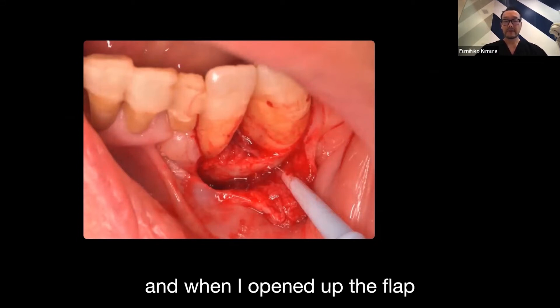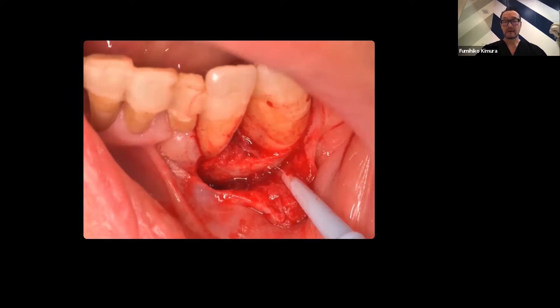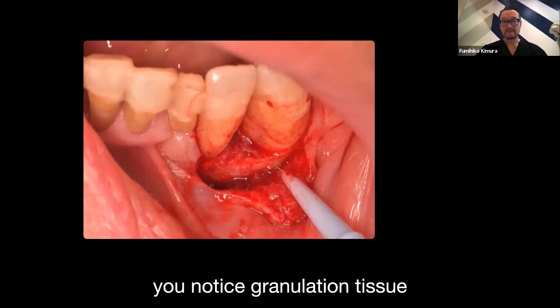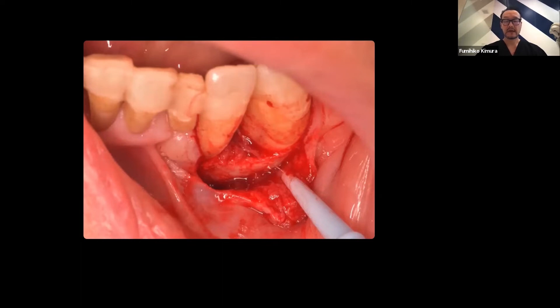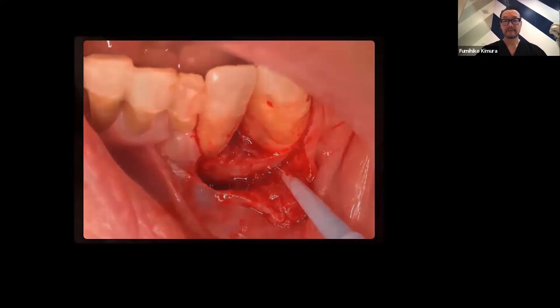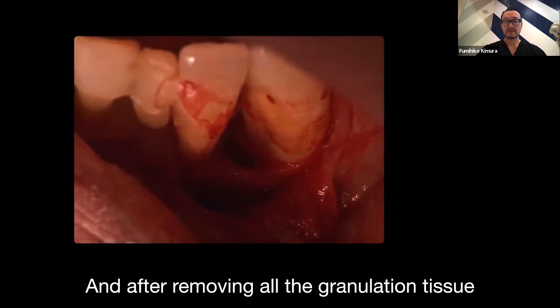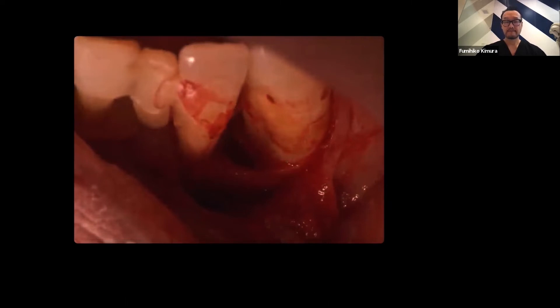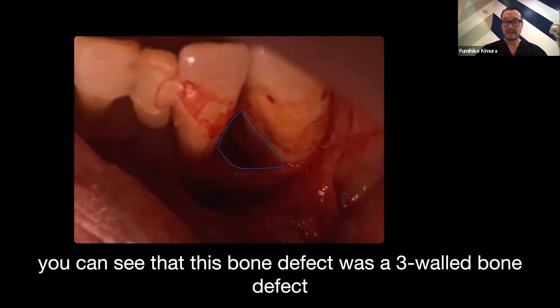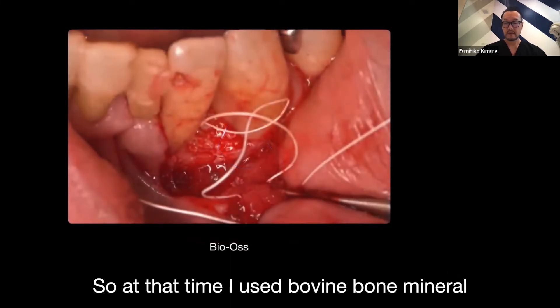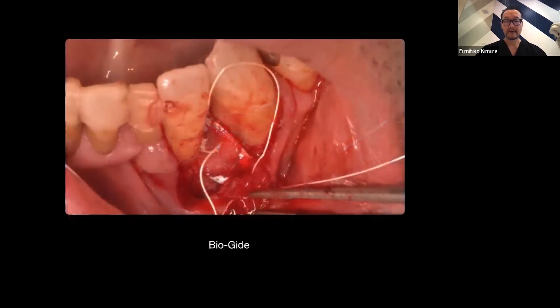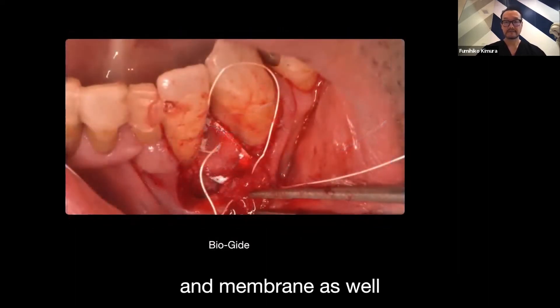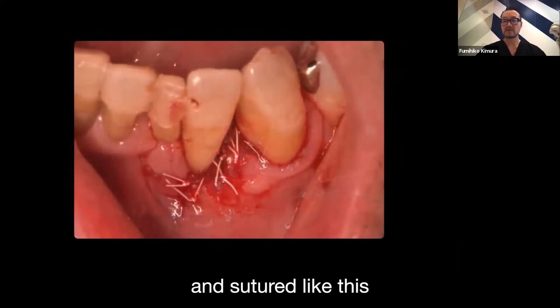When I opened up the flap, you notice granulatory tissue in the bone defect. After removing all the granulatory tissue, you can see that this bone defect was a three-wall bone defect. At that time, I used bovine bone mineral and a membrane as well, and sutured like this.